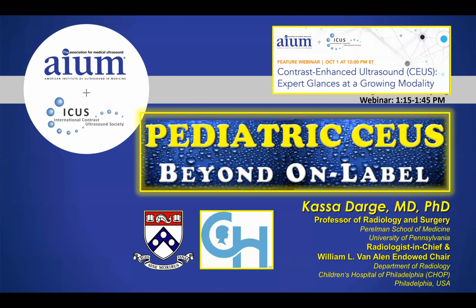Good afternoon, everyone. It's such a pleasure to have so many people attending the Contrast Enhanced Ultrasound webinar. I'll be focusing on pediatric applications and particularly go beyond the on-label applications and describe the current advances and future potential applications that may be happening in children.